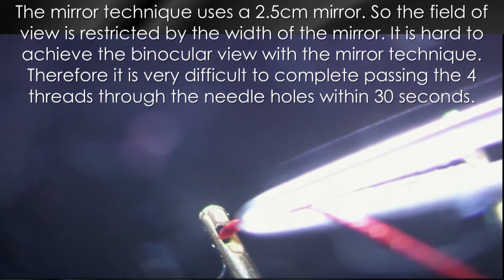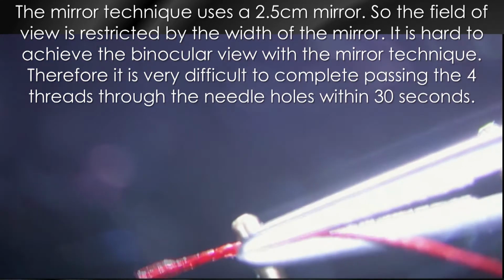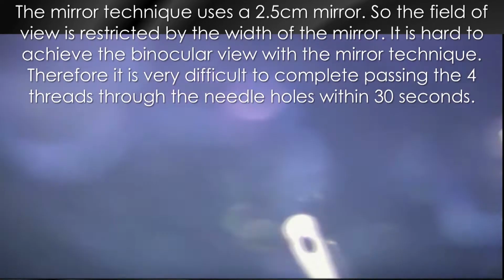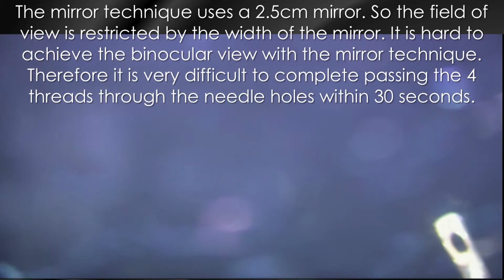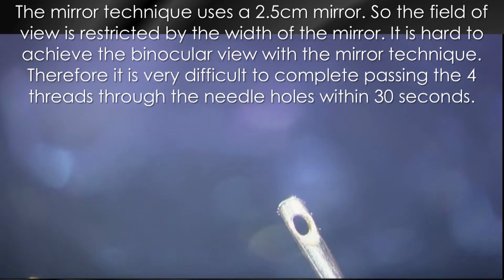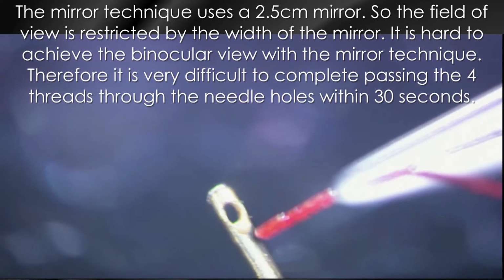So I can pass the thread, but I miss the needle hole. This is a wrong hole. Here, this is the next.